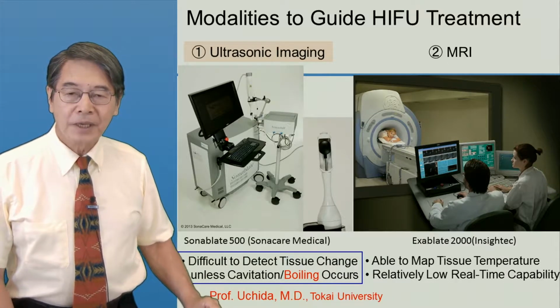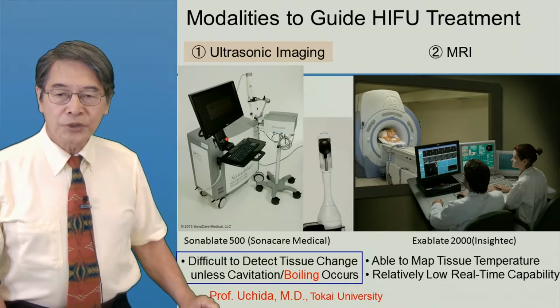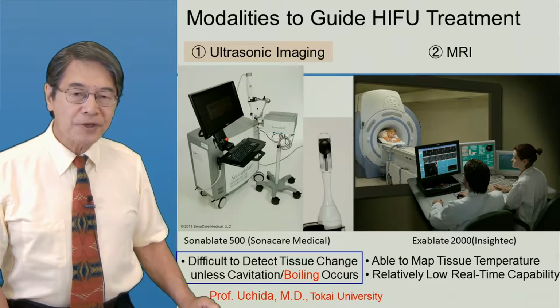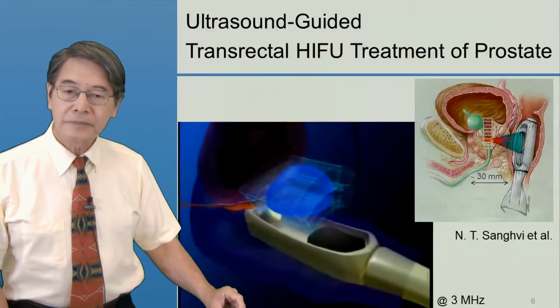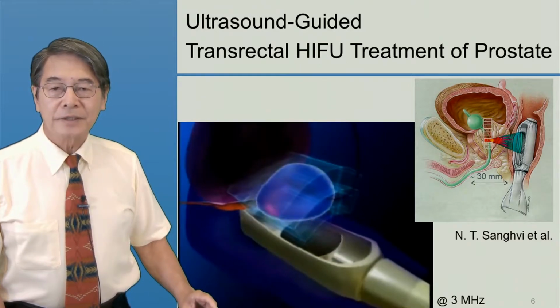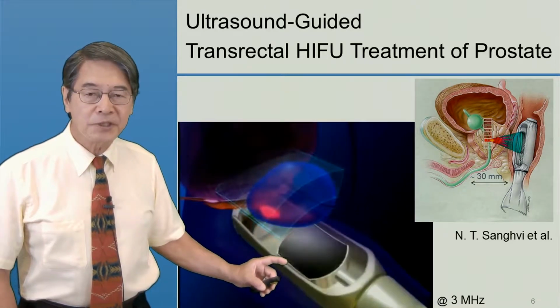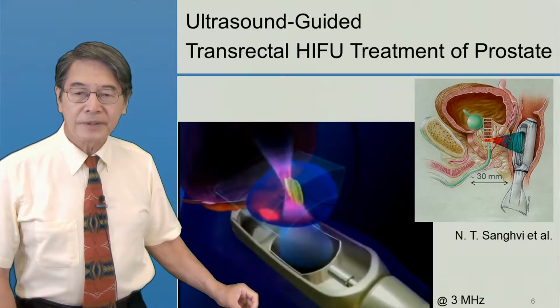However, Dr. Uchida of Tokai University is using this boiling event to control the tissue temperature in his clinical treatment of prostate. Dr. Uchida is using an ultrasound-guided transrectal HIFU treatment machine which Narendra Sanghvi had developed.